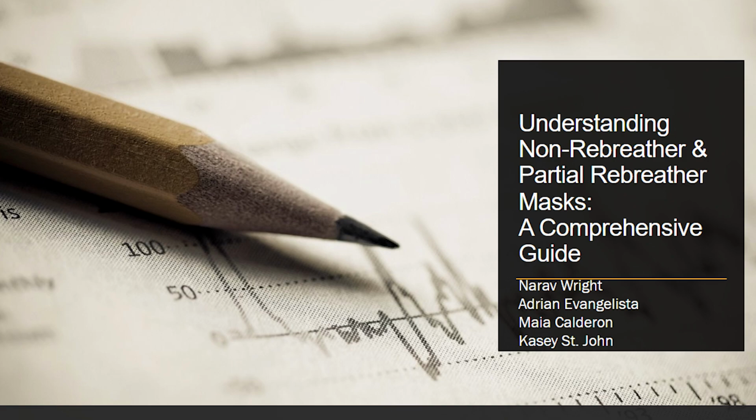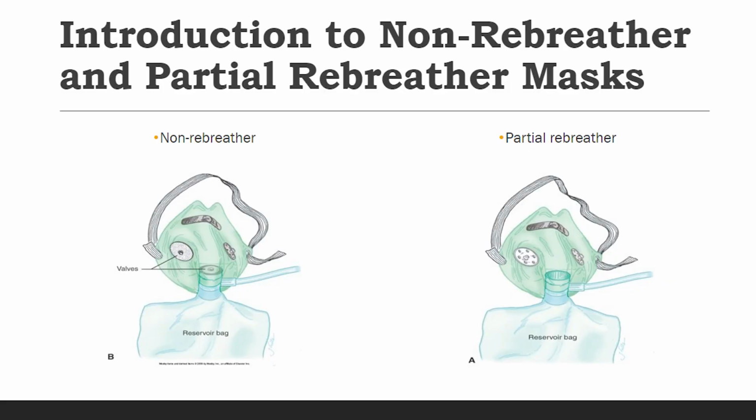In this video, we'll explore the purpose, components, and usage of these important medical devices. Let's begin. Introduction to non-rebreather and partial rebreather masks.